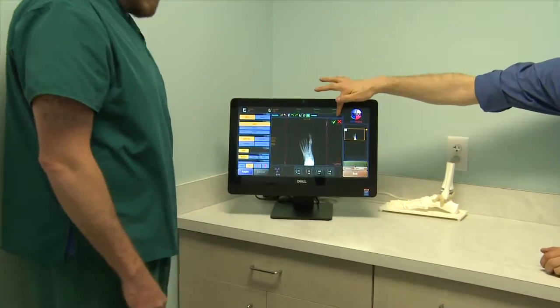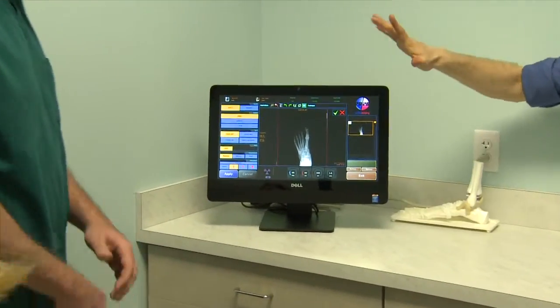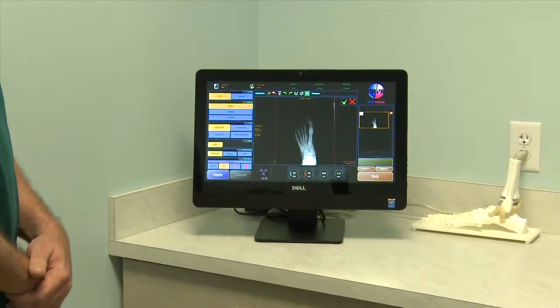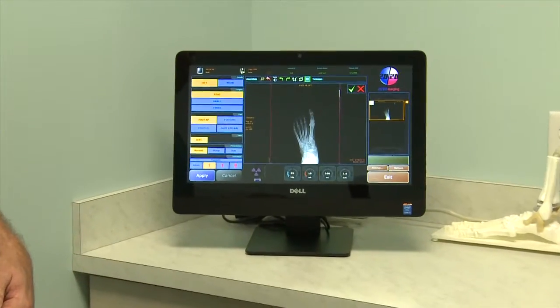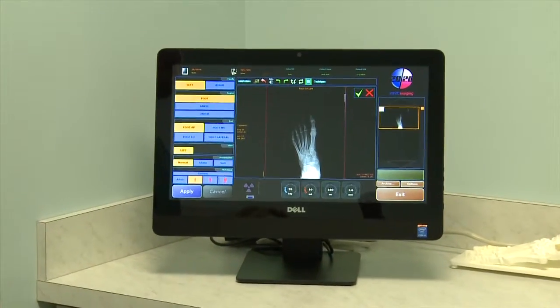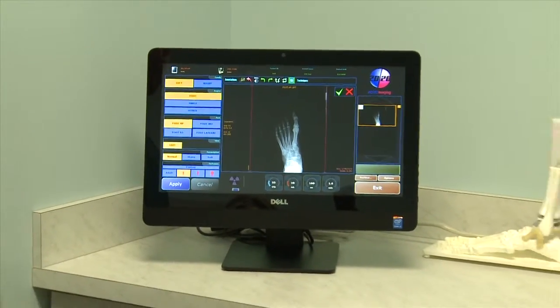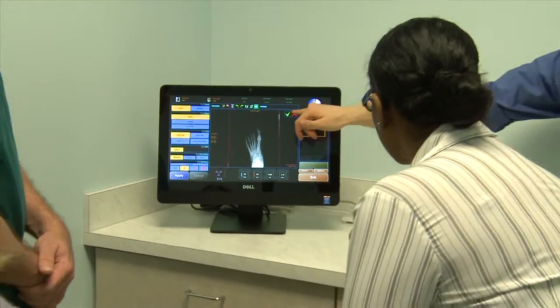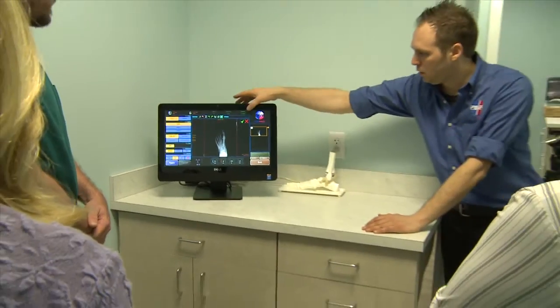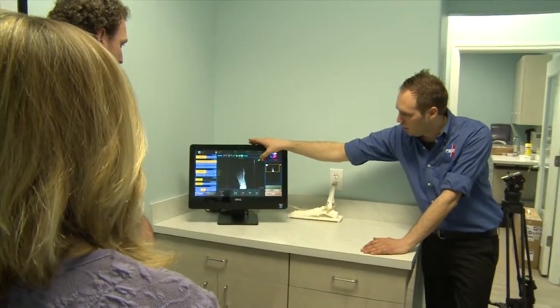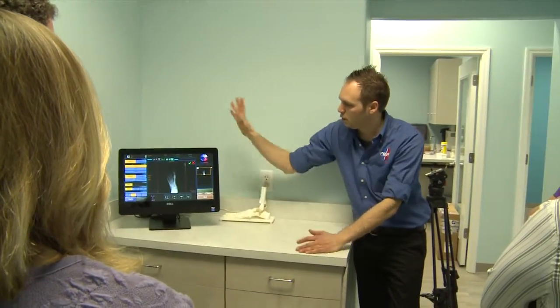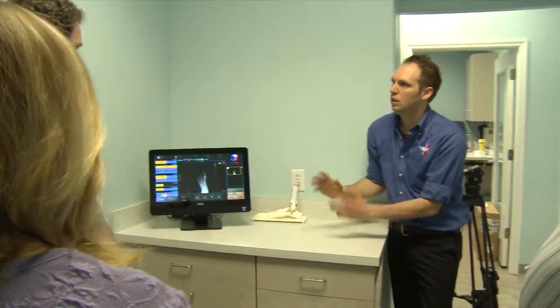After each view you have the option to accept or reject. You can do this after each x-ray, or do it all at the end — it's up to you. There's an accept and reject option at the top. Once you hit accept, it saves the image and starts sending it to the server in the background.